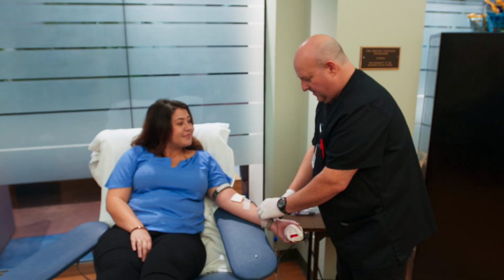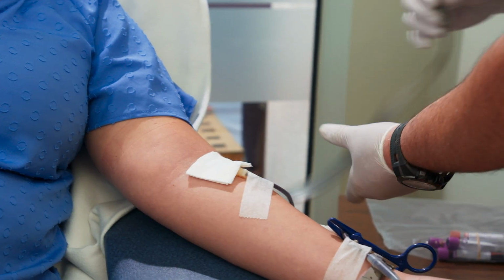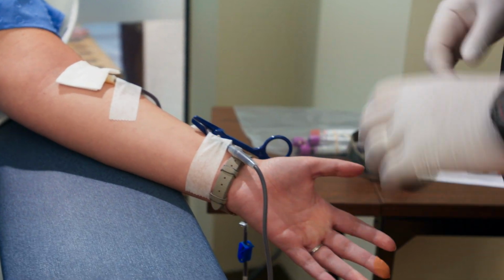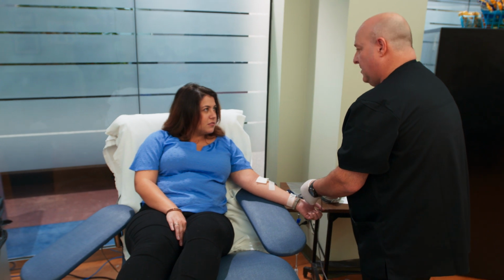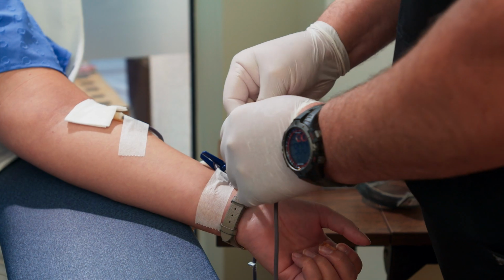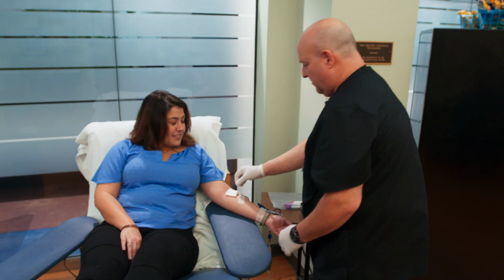All right, you are done. All right. Excellent job. That was easy. Still feeling well? I feel great. So how quickly will my blood be processed and go to someone? Typically within the next 48 hours. And then once we're done, we're going to have you stay in the chair for a few minutes and we'll get your refreshment, okay? Ready for the needle to come out?